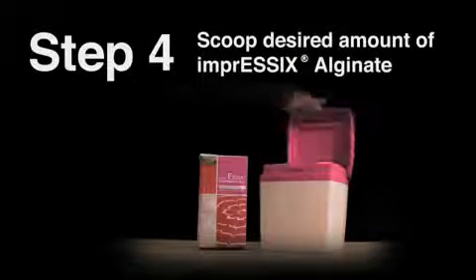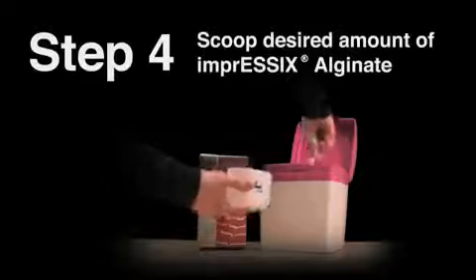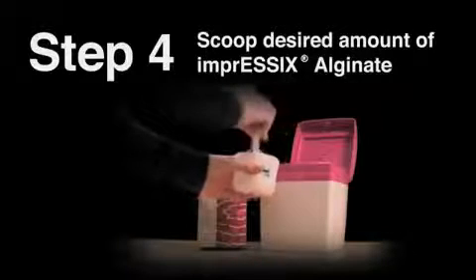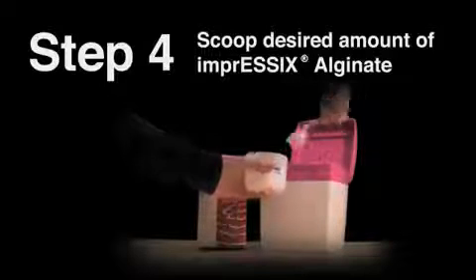Using the provided scoop, place the desired amount of Impressex into the mixing cup. The edge of the canister can be used to level the scoop of alginate. Mix Impressex Alginate using a 1 to 1 powder to water ratio. A standard upper impression requires 3 scoops of alginate.